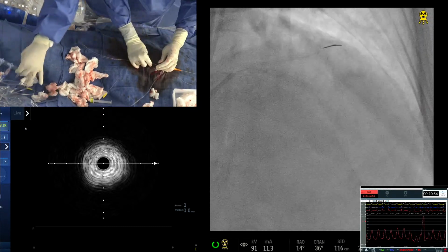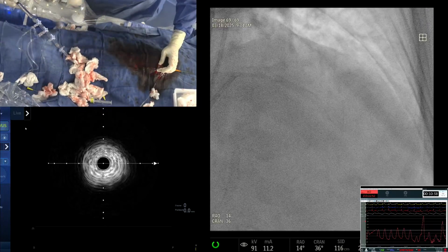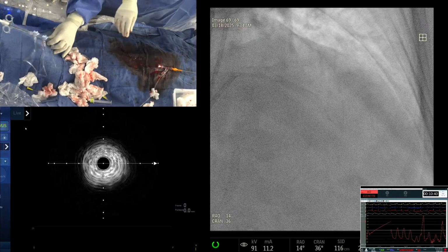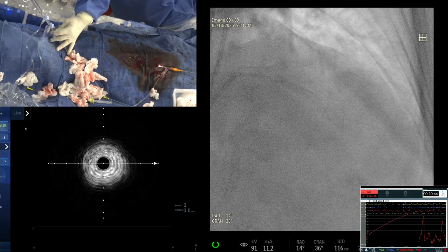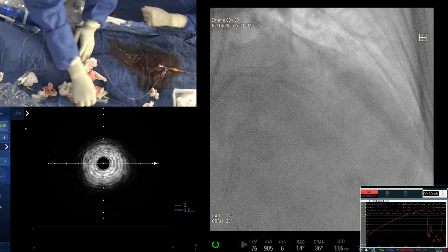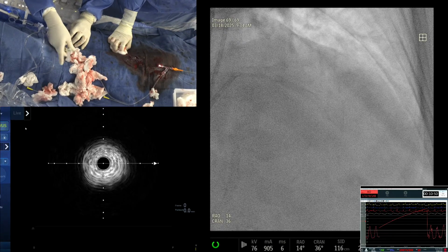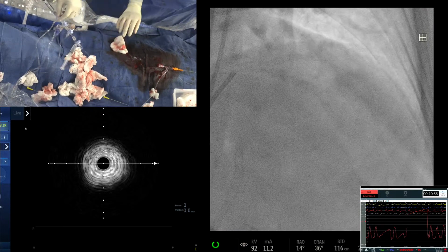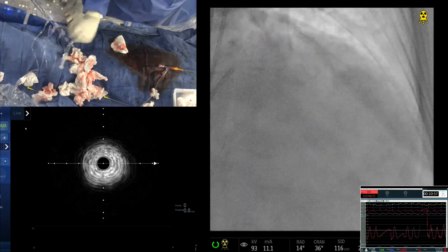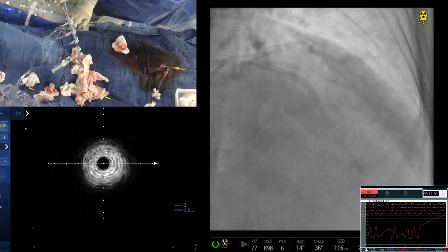Okay, let's take pictures, and then we are done with the last picture now. So just to say, once you have this kind of bifurcation lesion, your first balloon after crossing should be 1.5, not bigger. 1.5. So you had done that, and then you did not. Then you recrossed to a different cell, recapitulating what Anu just said. We say first go to a different cell first. Yeah, different cell, 1.5 balloon, and then you do.